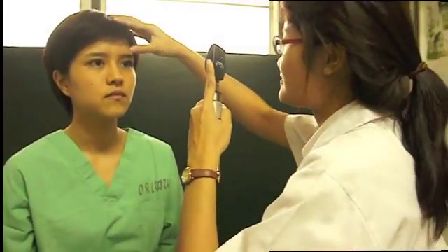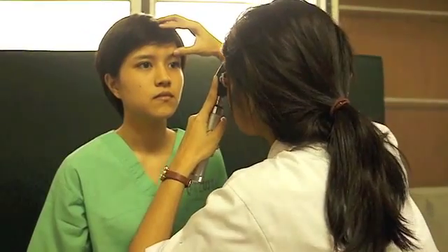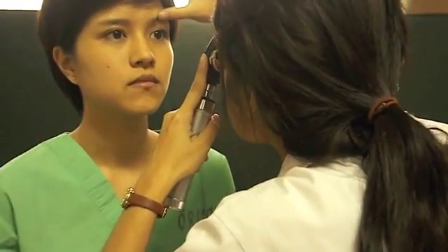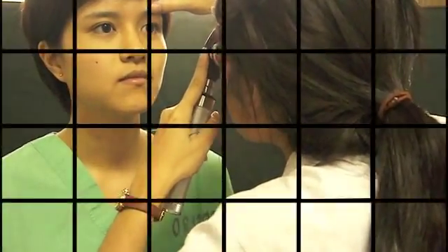หลังจากนั้นจึงตรวจตาซ้ายต่อตามขั้นตอนเดิม เป็นอันเสร็จวิธีการปฏิบัติ การรายงานผลการตรวจจอประสาทตาประกอบด้วย การดู Red Reflex, Optic Disc, เส้นเลือด, Retina และ Macula (Then examine the left eye following the same steps — this completes the procedure. Reporting the fundoscopic examination includes assessment of Red Reflex, Optic Disc, vessels, Retina, and Macula.)